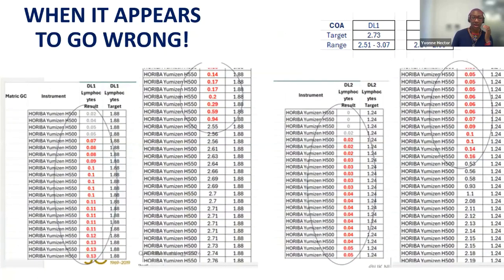And you can see again the same difference was observed in our DL program. With our DL program, this is commercially obtained material, so we do obtain a certificate of analysis with this material. When we looked at the certificate of analysis, we were able to ascertain which participants seem to be obtaining the correct results.